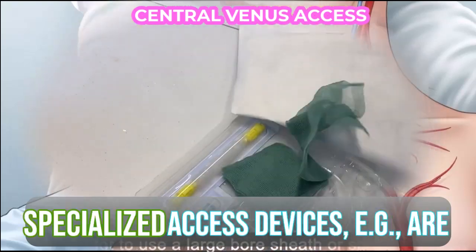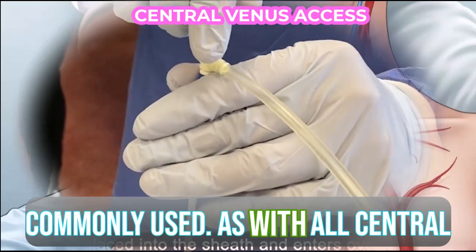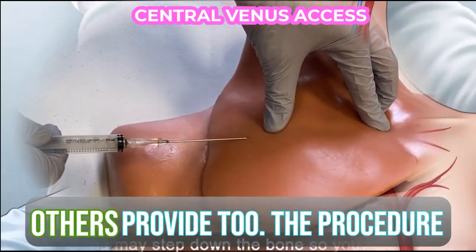Large bore sheaths or specialized access devices, e.g. a MAC line, are commonly used. As with all central lines, the device must be flushed and primed prior to insertion. Some devices may have a single port, while others provide two.